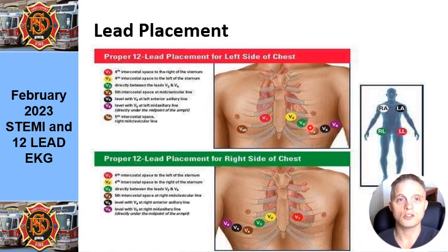Now I know that sounds surreptitious. If you learned it another way, that's more than appropriate as long as we get the correct positioning. We don't want to be putting the precordial leads up on the shoulders or higher than the 3rd intercostal space. You want it to be at the level or just underneath the nipple line. That can be somewhat difficult, especially with people with gynecomastia or large breasts. You won't be able to clearly see where the nipple line is, but what we can do is identify where that 4th intercostal space is, and if you need to walk down the rib margins, then do so.